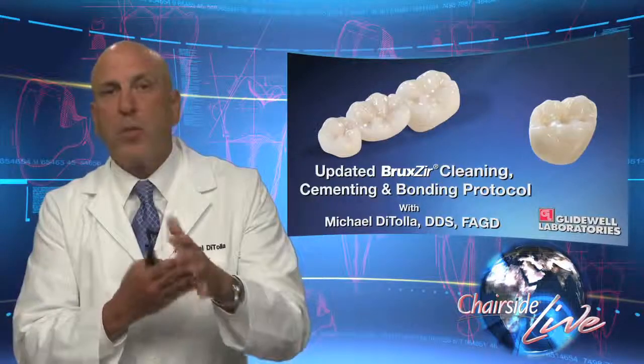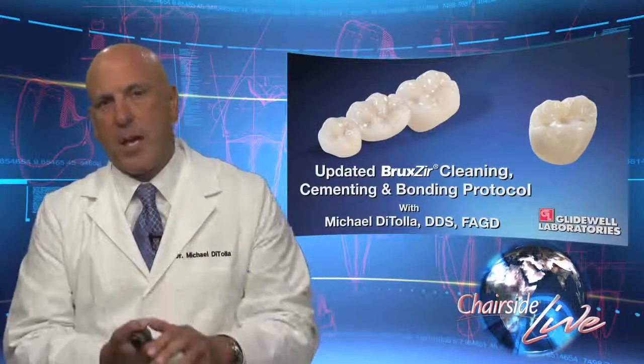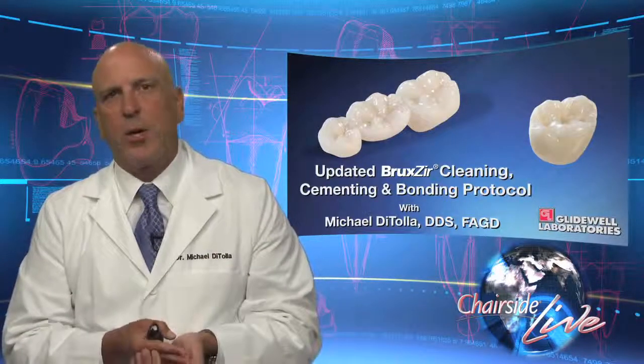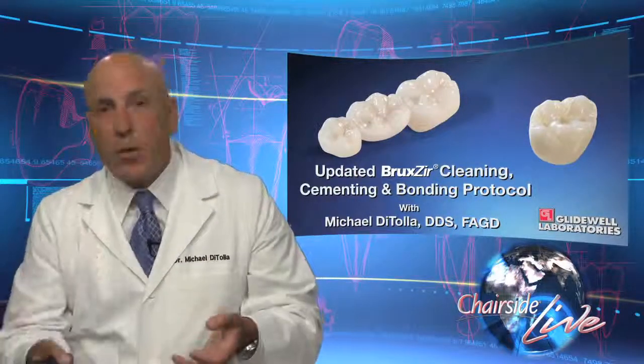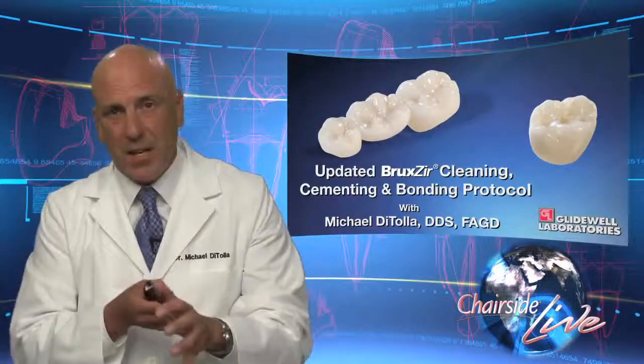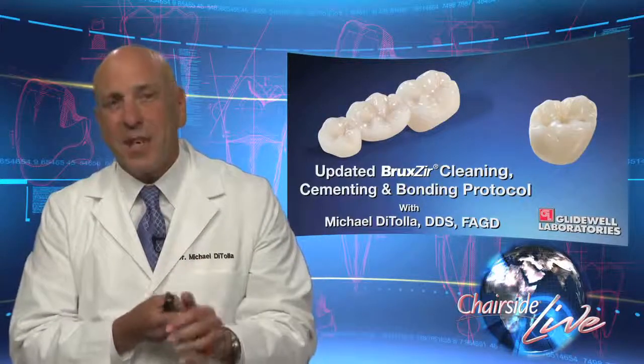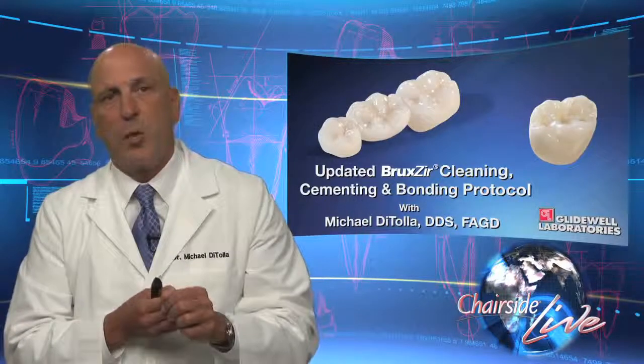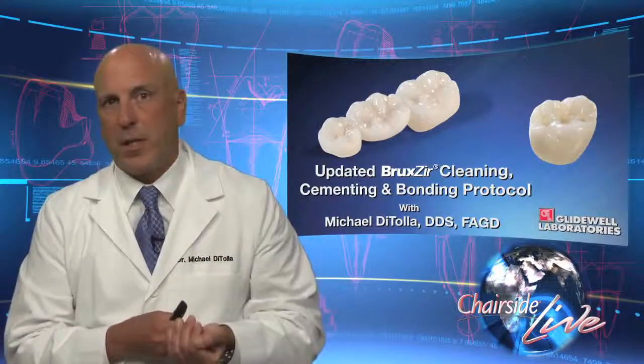As a result, all the bonding sites are now taken up. Regardless of what you do at this point, you're not going to get a good bond between the cement, or the silane, or anything, and the zirconia crown because of the contamination from the saliva and these phosphate groups. So you might ask yourself, how am I going to be able to clean this out?